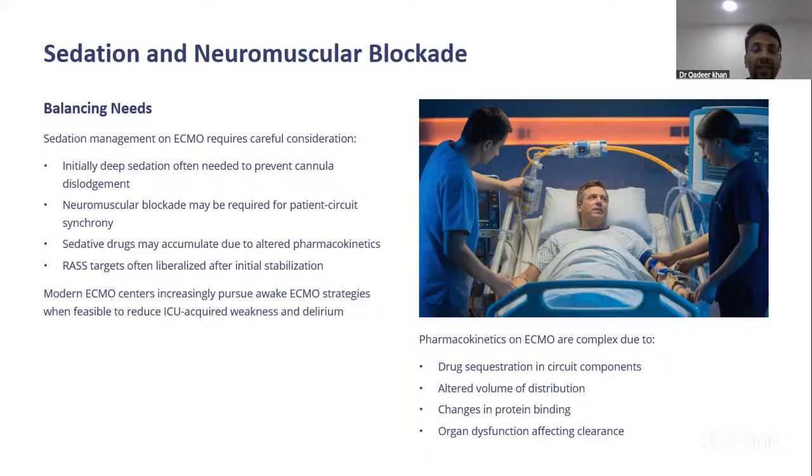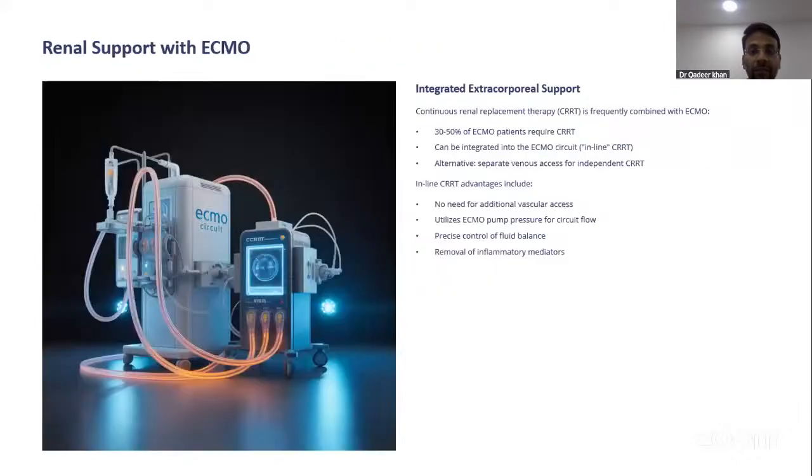And what we need to understand is the extracorporeal circuit. When we connect the patient to an extracorporeal circuit, there will be drug sequestration. So you may need to give a larger amount of sedations or analgesics to maintain the patient and decrease the oxygen consumption.